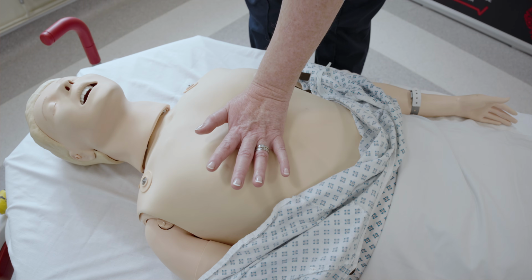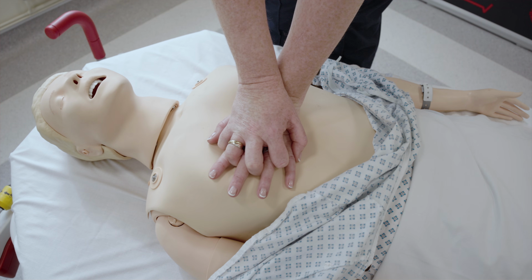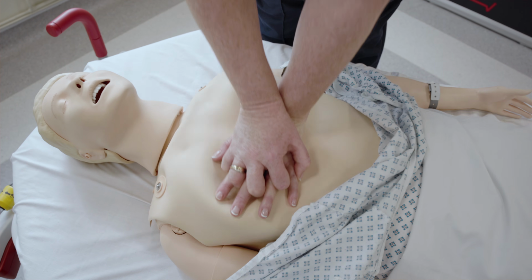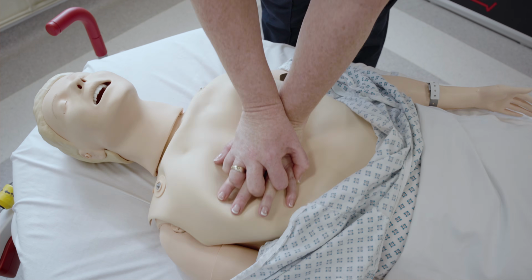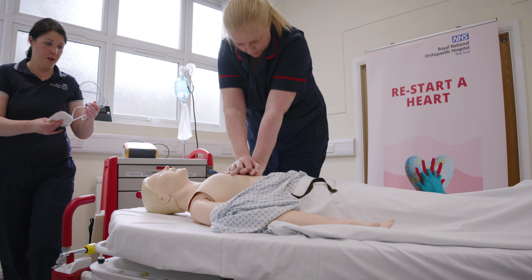Place the heel of your hand on the lower third of the sternum, interlock your hands and lock out your arms. If you require a stool for this, there is one located on the bottom drawer of your crash trolley. Start CPR with a chest depth of 5 to 6 centimetres for an adult and a rate of 100 to 120 beats per minute. Once the crash trolley arrives, apply the defibrillator pads.